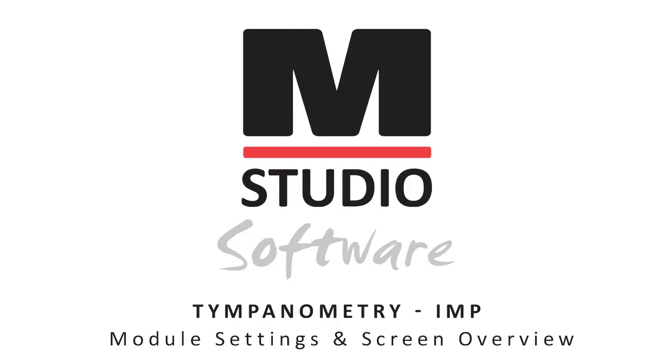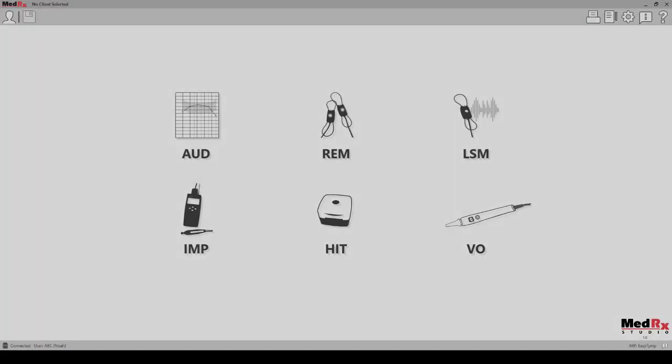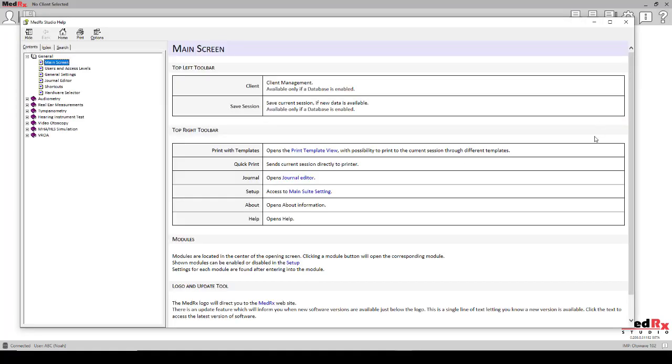Impedance screen or tympanometry. The purpose of this tutorial is to get you up and running with your MedRex Studio software. Please consult the interactive help system within the Studio software for more detailed information on features and functionality.